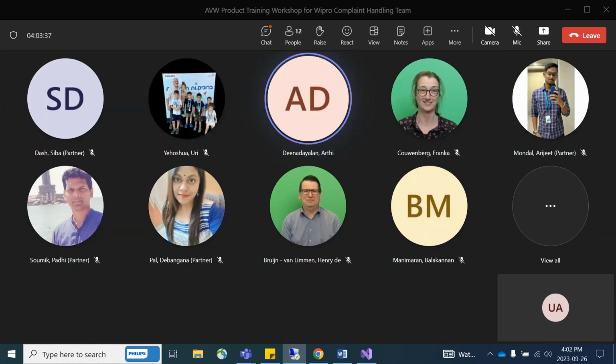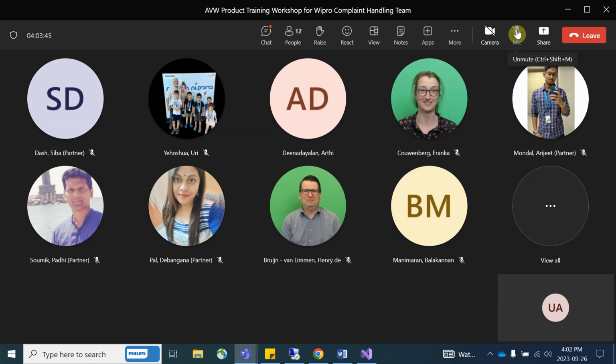So any questions so far? Hopefully you guys understood those applications, and these are the basic functionalities. So whatever data sets I showed you, just try those data sets.